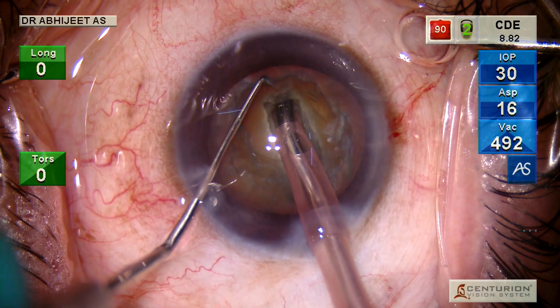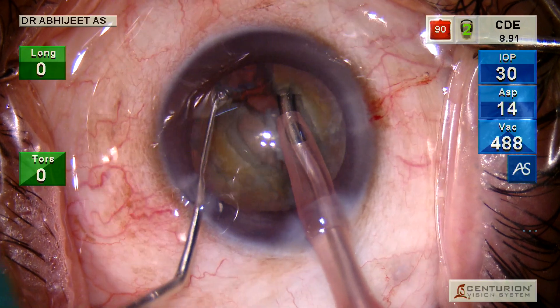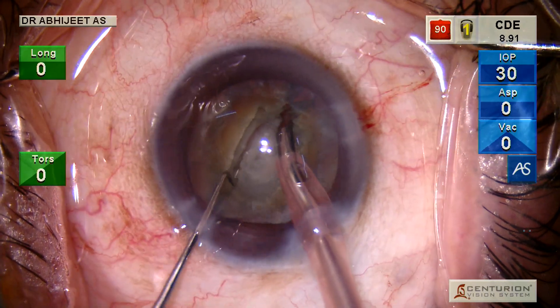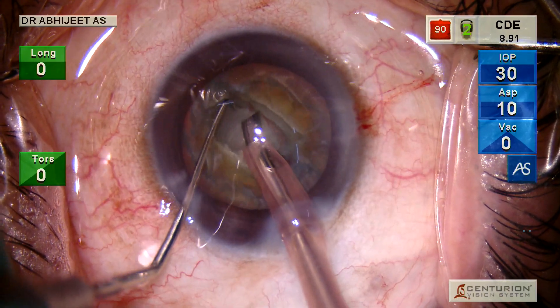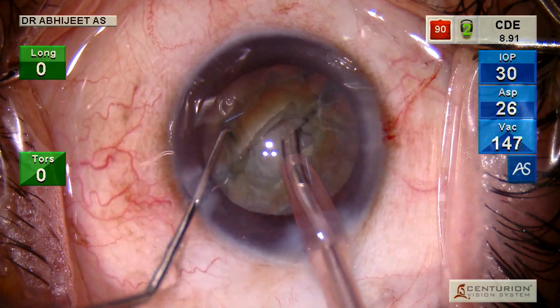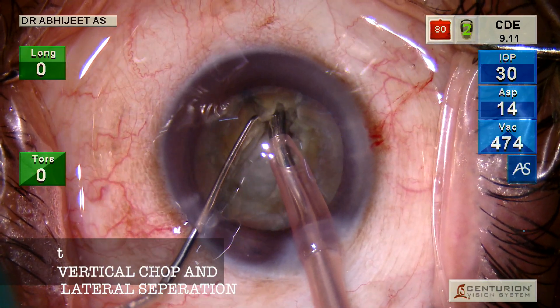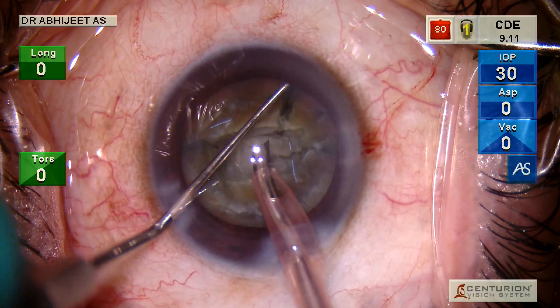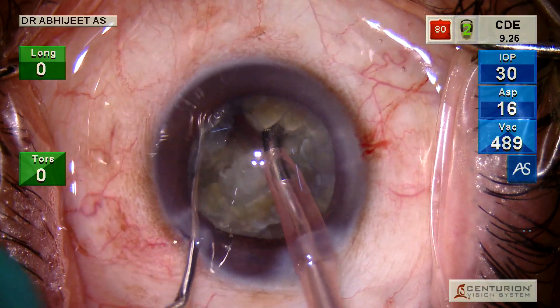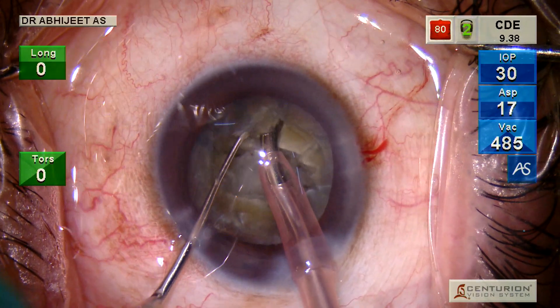Here we are using a chopper, which is like a tapered-point, long Sinskey-type instrument. We initiate the first crack, rotate, and complete the crack. See to it that the surface posteriorly is broken. Then at the right place to bury the tip, you do a vertical chop and a lateral separation — mind the direction in which I am initiating the chop and doing the lateral separation.